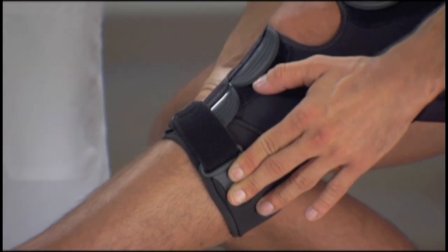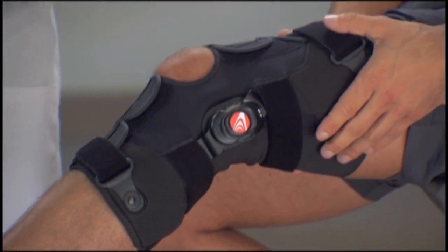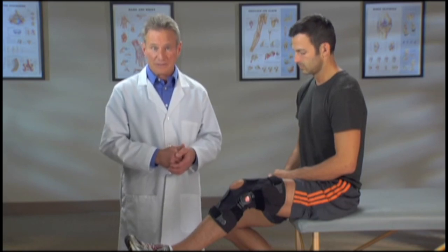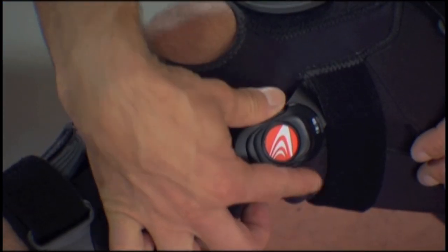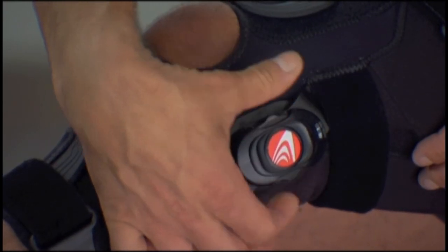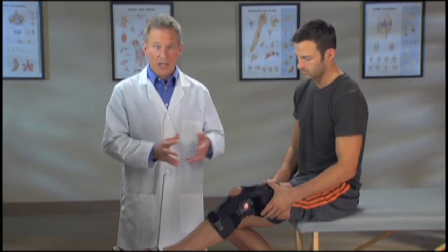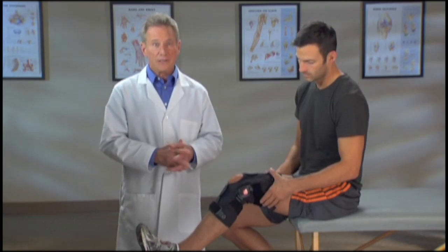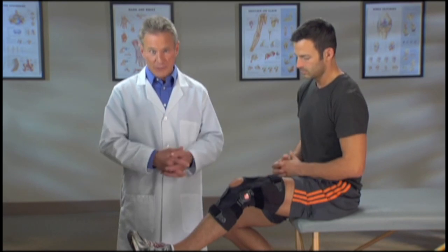Your Freestyle OA brace has a thumbwheel dial, which makes it easy to adjust the amount of force applied to your knee and provide pain relief. Turn the dial clockwise to increase pressure to the outside of the knee, and counterclockwise to reduce pressure. Make sure you start with a low setting to allow your knee to adjust to wearing the brace.